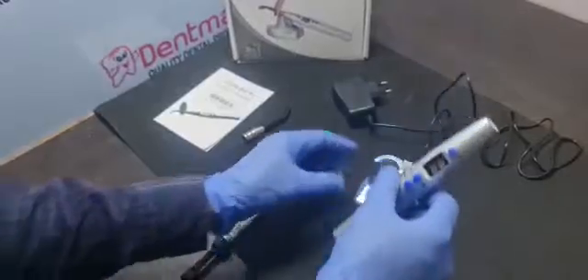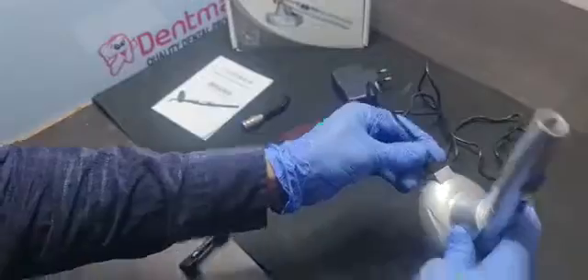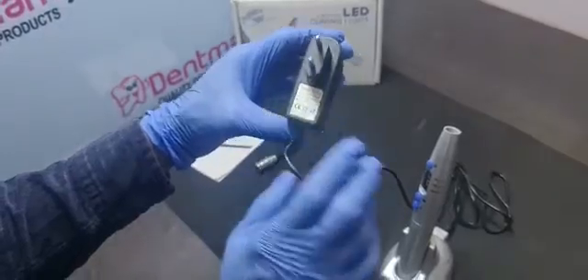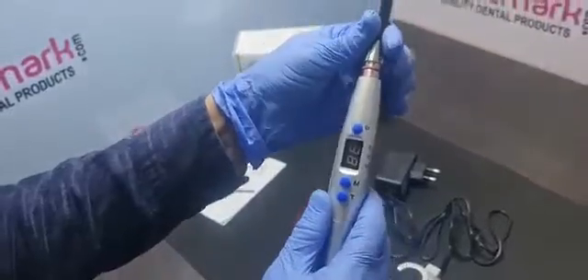This is the light cure charging stand and this is the charger. This charger supports 100 to 240 volt input, so you can use it anywhere in the world. Attach this probe like this.